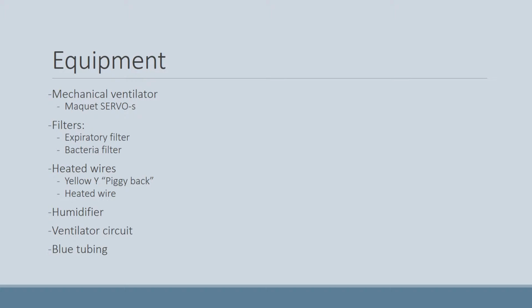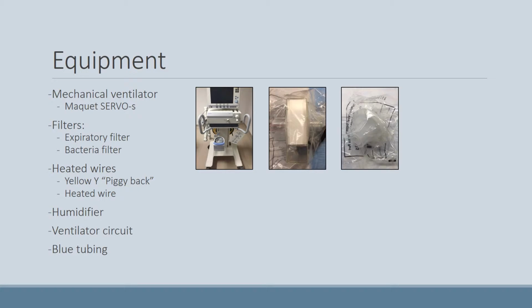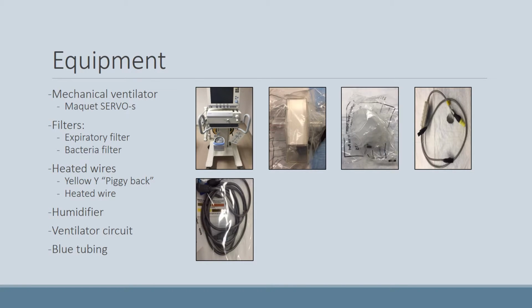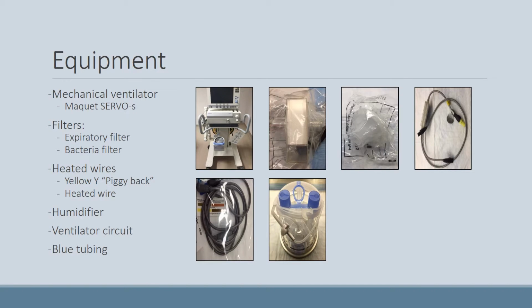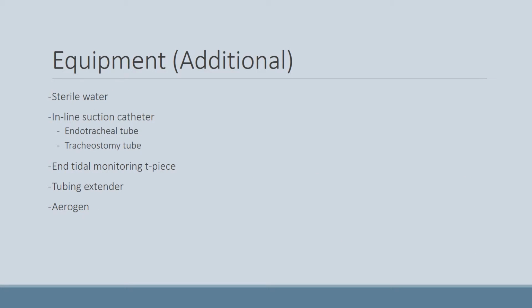The equipment we'll be using today is an actual Servo S ventilator. Pictured here is a Servo S mechanical ventilator that has no setup on it yet. Two different types of filters: an expiratory filter and a bacterial filter. Your heated wires are going to be your yellow Y, commonly known as a piggyback, and your actual heated wire itself. You'll need a humidifier, which sits right on the plate of the Fisher & Paykel that heats the sterile water. A ventilator circuit, and blue tubing. Any additional equipment may be added later on after the setup is complete.